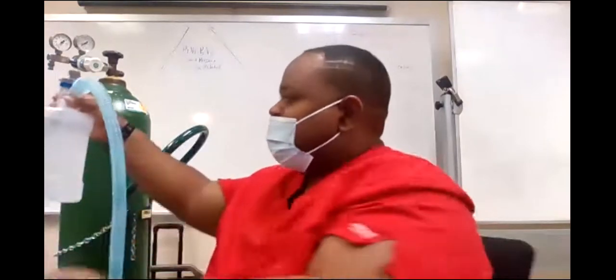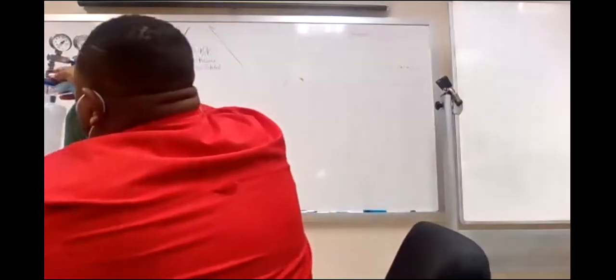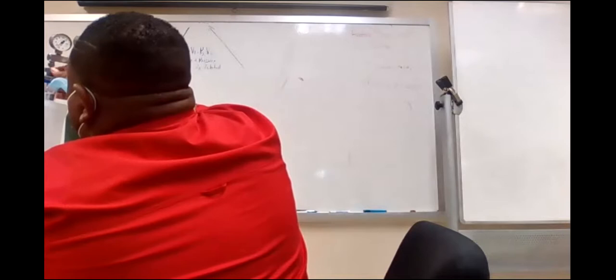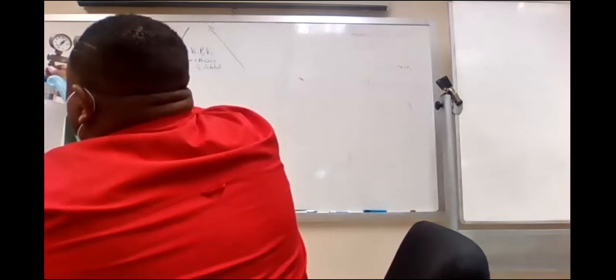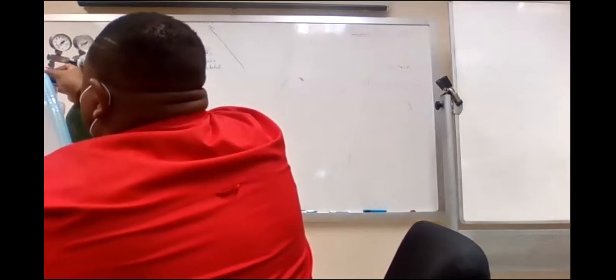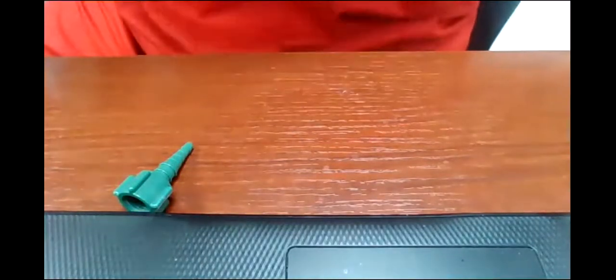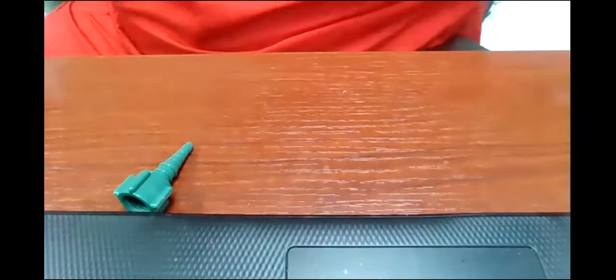So how do you connect the? It's gonna go just like this. Oh, sure. Screw right onto our flow meter. I was definitely not expecting that. I thought he was gonna hook another tube. This is your flow meter, just like this. If this is coming out the wall, you plug it up, screw it to that, and turn your flow to whatever, okay?